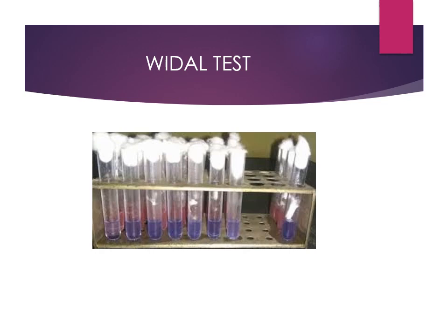Depending upon the zone or area where you are doing this test, you can say that if the titer is going above a certain value for the TO, or above a certain value for the H, then the test is positive. Usually we do not give positive results on the basis of a single test. If we notice a positive result, we ask the patient to come after 2 weeks and put up the test again. If you notice a rise or a fall in the titer, then it is a confirmatory test that the person has typhoid.